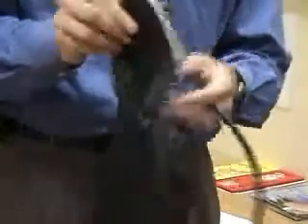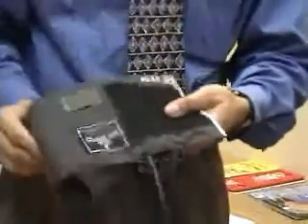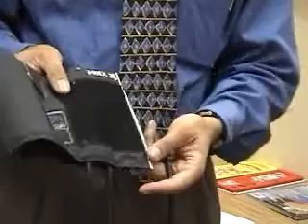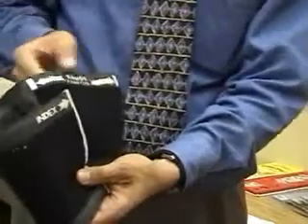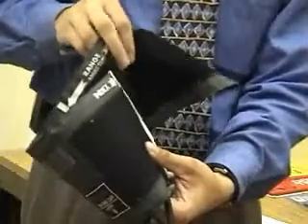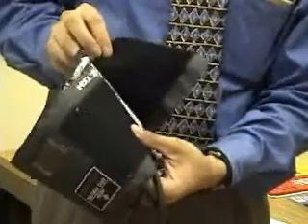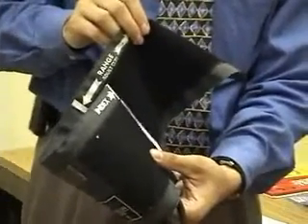We're going to check the blood pressure. First, you want to be sure that you have an appropriately sized blood pressure cuff. You also want to note the size of the bladder, which is the part of the cuff that you inflate. Most cuffs will have one edge marked with a white line. On the back part of the cuff, they'll demonstrate the range for the appropriate size. Cuffs that are too small tend to overestimate a patient's blood pressure, and cuffs that are too large will underestimate it.